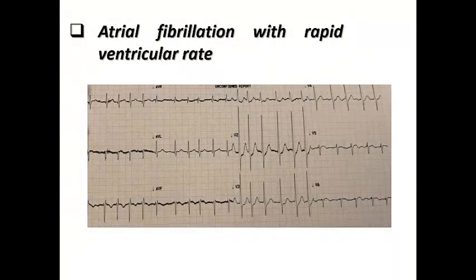AF with rapid ventricular rate can also cause ST depression — as seen here with depression from V1 to V4. The mechanism is nearly the same as SVT: either rate-dependent myocardial ischemia or repolarization abnormality with rapid AF.